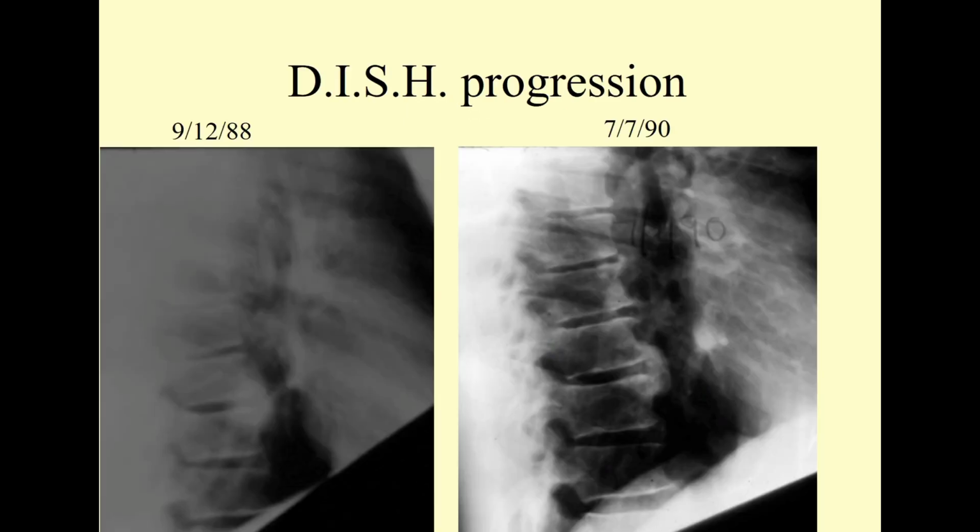Now, next I'll be showing you a series of images that I got from Scott Air Force Base. Actually, a patient I had rotated out of the service, stayed in the area, was seeing one of our referring clients, and the referring client could get the images but not the reports from the military. So they asked us to generate reports on these.